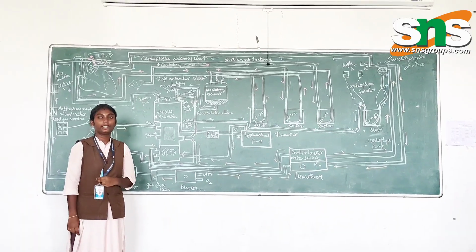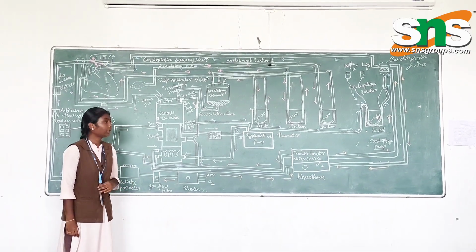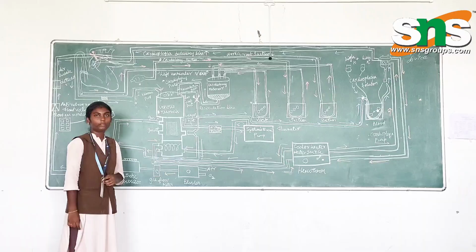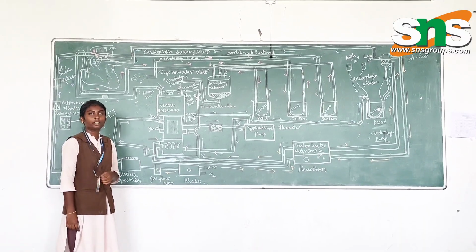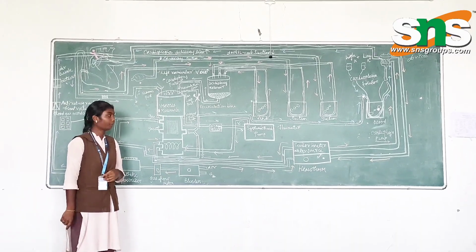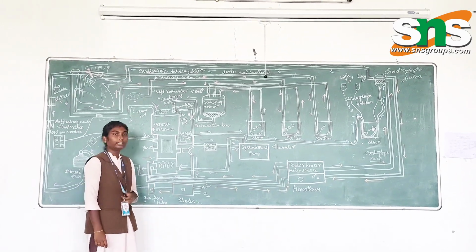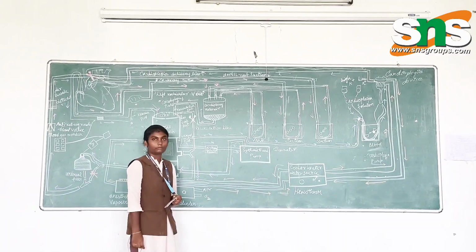Heat exchanger. The heat exchanger is an integrated component of the oxygenator. The vital function of the heat exchanger is to maintain the temperature of the patient's body by increasing or decreasing the temperature of the blood which is perfusing into the patient. Aluminium, glass and steel are good conductors of heat. The heat is transmitted to the heat exchanger through the hemotherm.